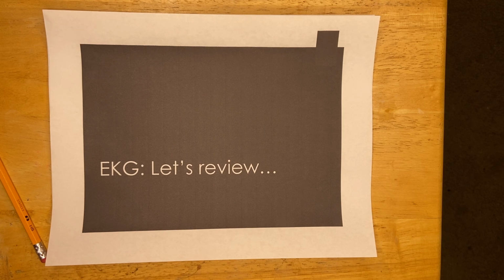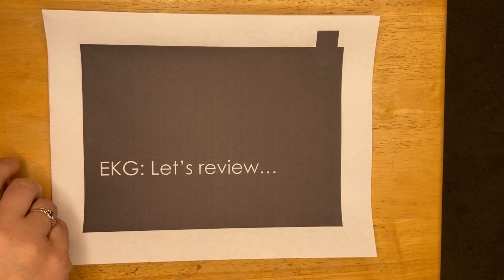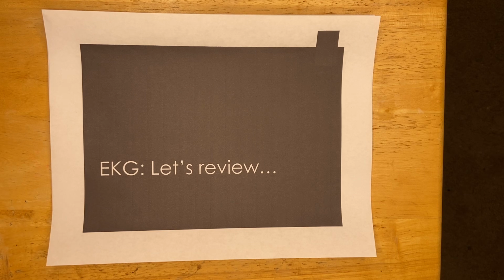This is the first video that we're doing for this class out of, I don't know how many, just depends on what I think that we need as we move through the semester. So I'm sure you remember, since it's due today, it was only last week that you worked on analyzing the strips in the 50 strip practice packet.